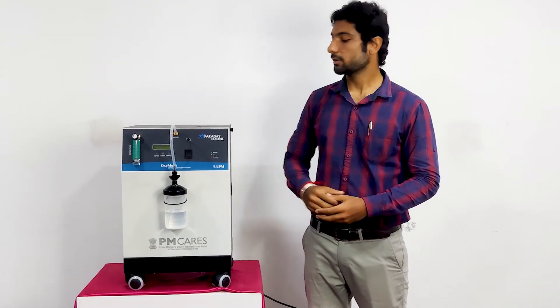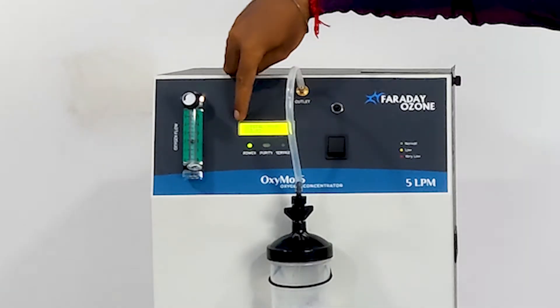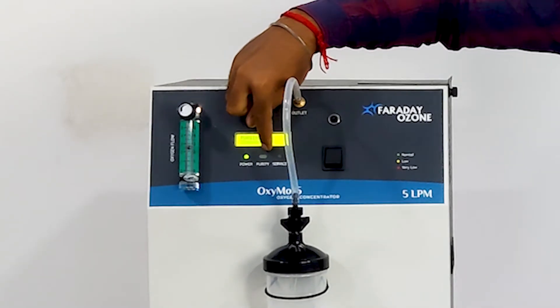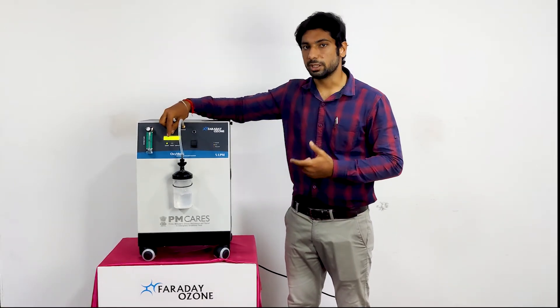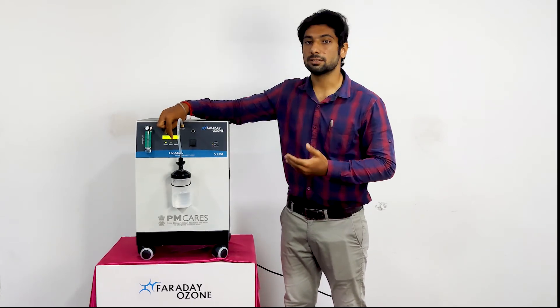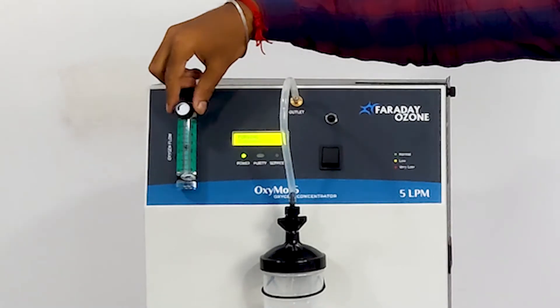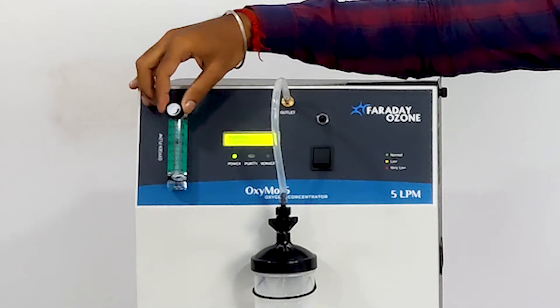Now press the switch on button. The machine starts to run. The display shows you the running hours and the purity of oxygen. Here we have a LED indicator — if the LED is green, the oxygen purity is high; if yellow, the purity is low; if red, the purity is very low. And here we have a service indicator.